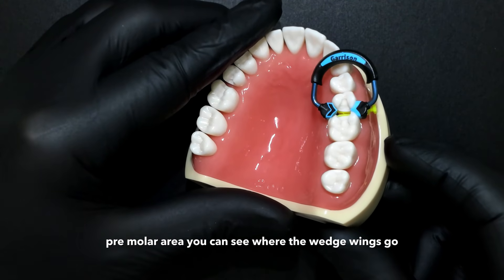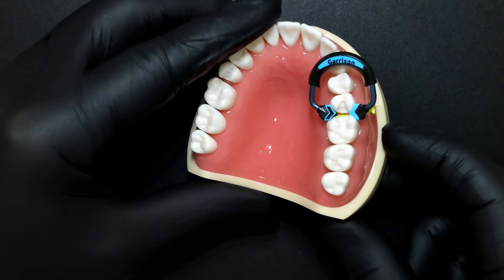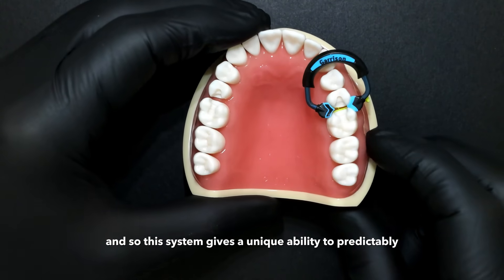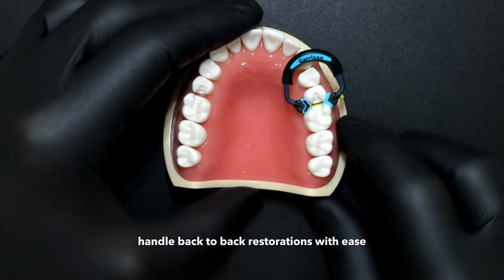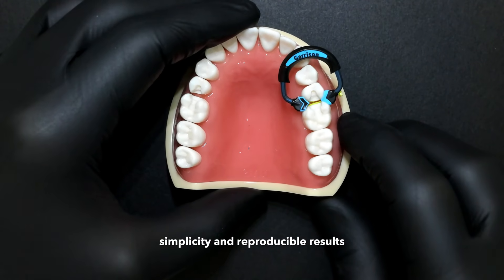You can see where the wedge wings go in yellow there in those embrasures. Guess what's going to follow? Your matrix bands. This system gives the unique ability to predictably handle back-to-back restorations with ease, simplicity, and reproducible results.